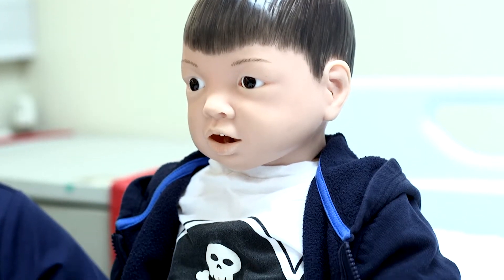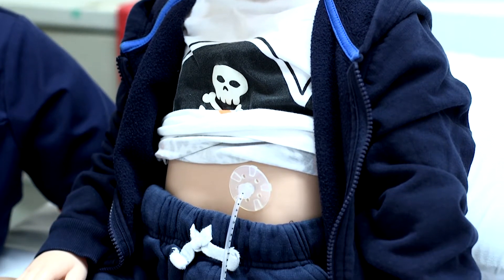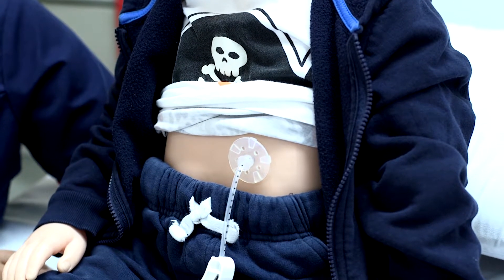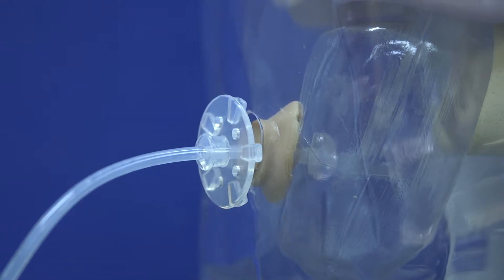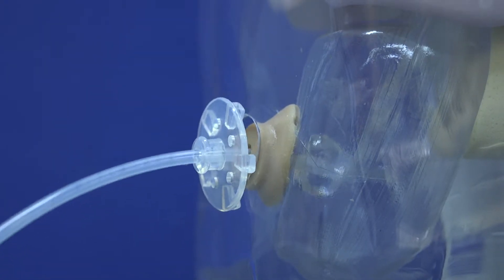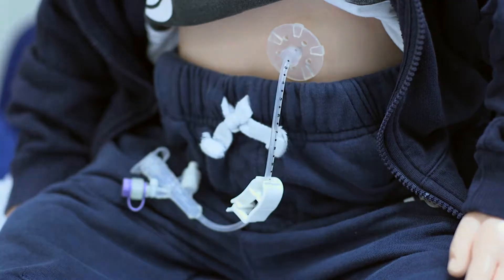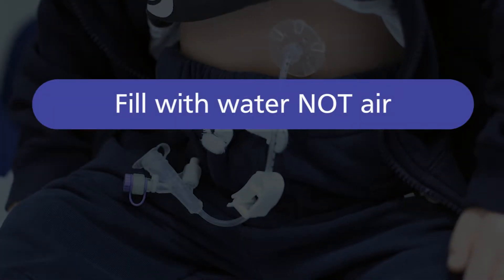Your child's gastrostomy is held in place by a water filled balloon. Over a period of time water can leak from the balloon which will cause it to shrink in size. You will need to check the water in the balloon on a weekly basis to ensure that the balloon is inflated and the tube stays in place. You should always fill the balloon with water and not air.